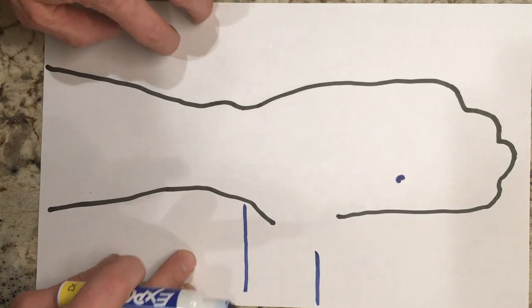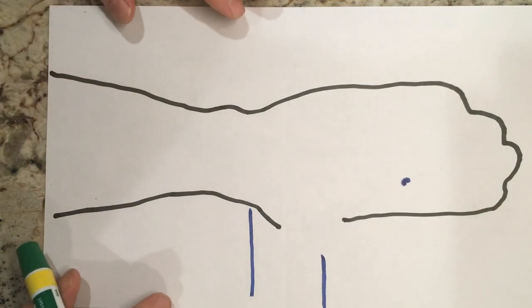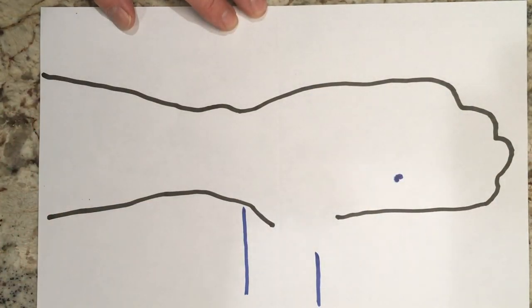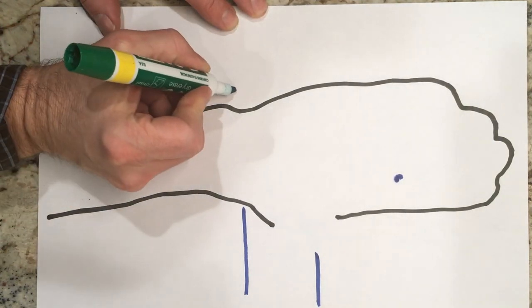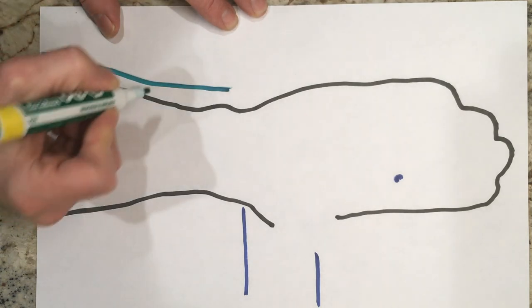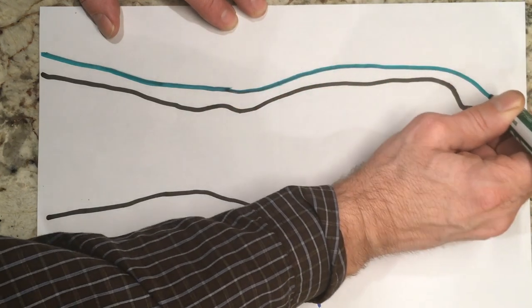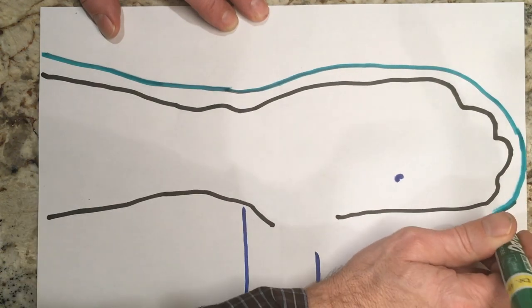Once you've done that, you can remove your client's hand. Now we're going to draw around this outline of the hand, expanding your pattern just a little bit so that you have enough room to wrap halfway around the forearm, contour up around the fingers and that sort of thing. So just doing this freehand, I would do something like that, be a little bit more over here, and then up here around the hand just enough so that you will have enough material to contour around the sides and bring it up a little bit.